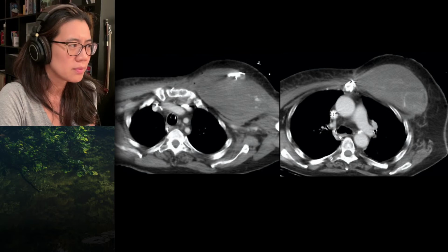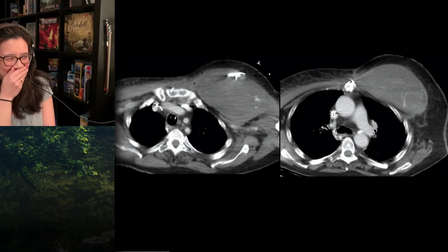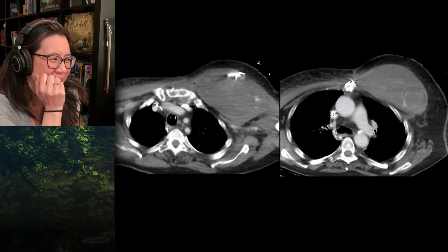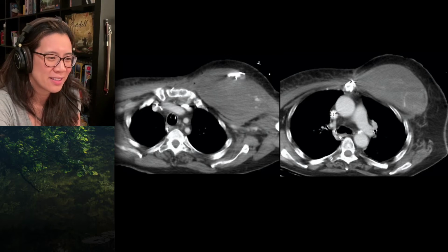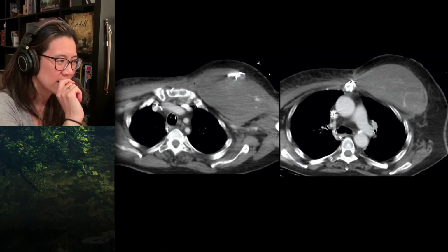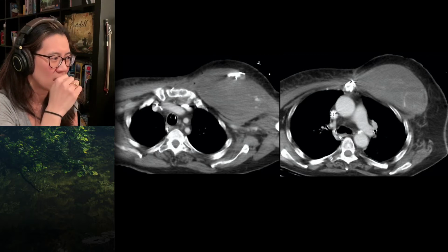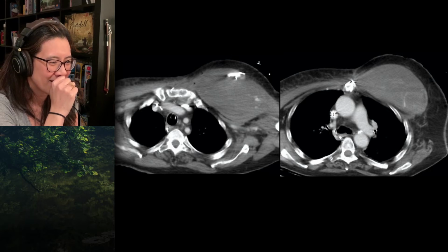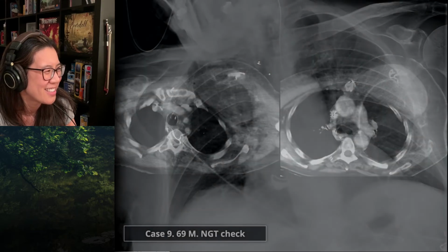I mean, they knew what his problem was. They could see it. It took them 3 days to do anything about it. Oh, that's not good. Oh, wow. So as a CT angio, 3 days afterwards, he got a huge hematoma. He's actively bleeding. Yeah. Golly, that's not good. So that was just one of the chest wall causes of one of these Harlequin x-rays. Nice. Okay, next smiling face.